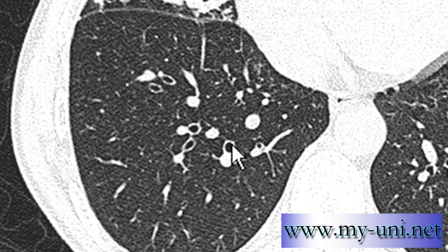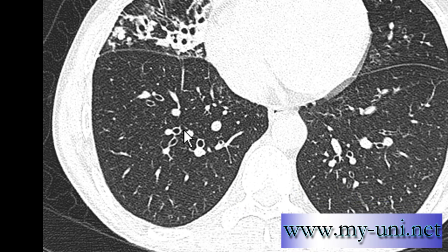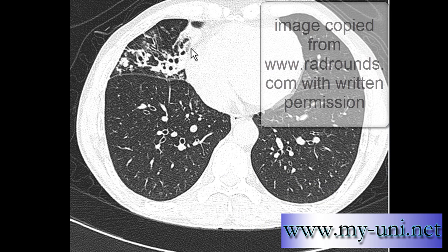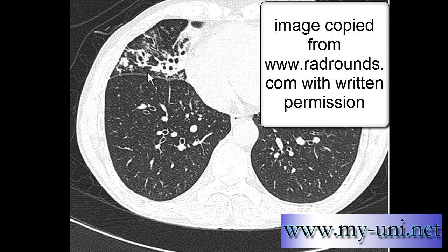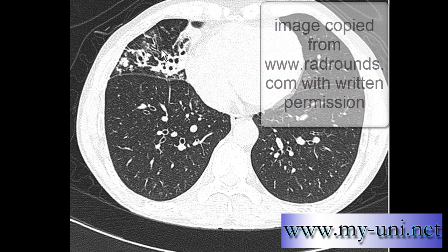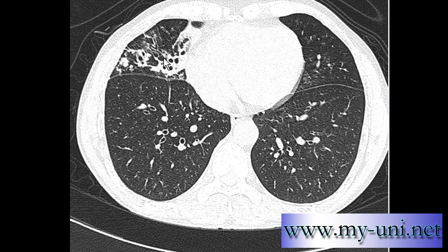This is probably a normal-sized bronchus — here the bronchus is smaller than the size of the artery. And you can see the signs of bronchiectasis: thickened bronchial walls and cystic changes with collapsed lung parenchyma. Thank you very much.